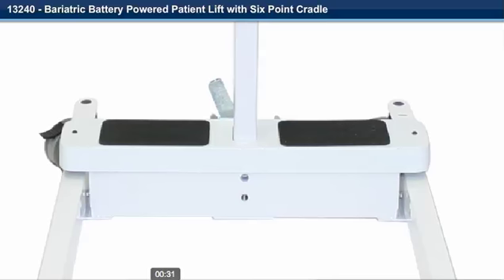Step 4. Install the mast into the base with the boom towards the front of the base.